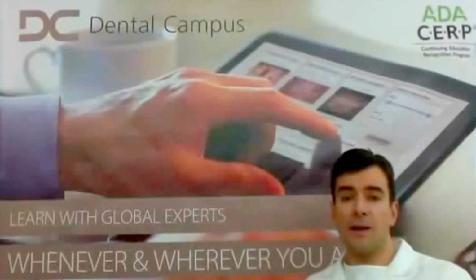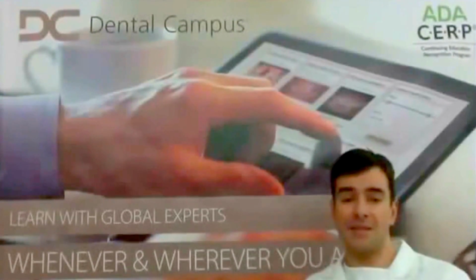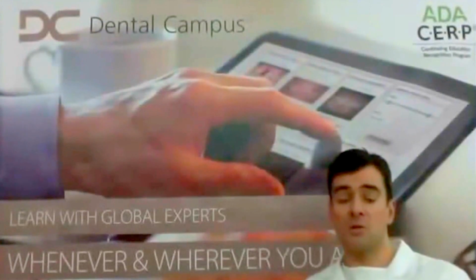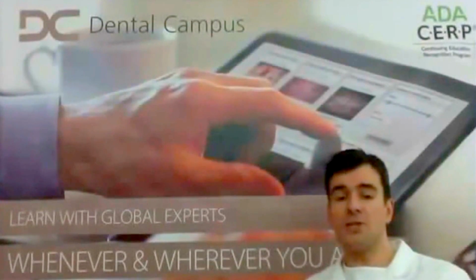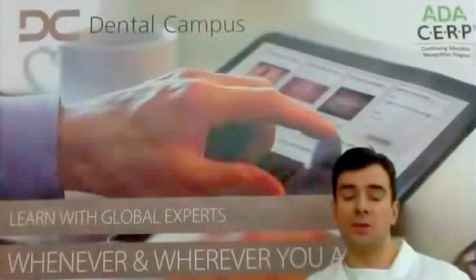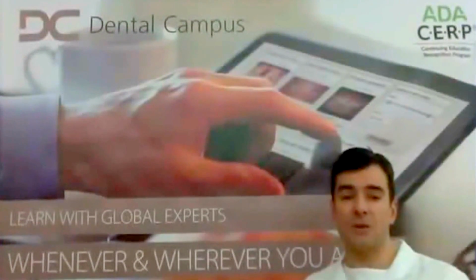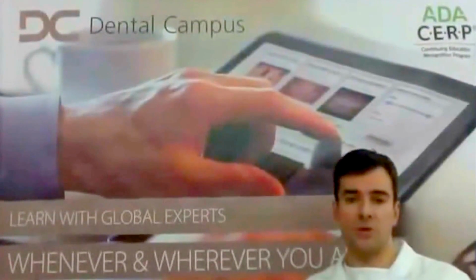If you take a look at the clinical literature, I would say 80 percent or even more of the clinical studies on immediate restoration, which by the way are showing very, very good data in terms of implant survival and bone stability, require at least 30 to 40 Newton centimeter of insertion torque, and the clinicians who are using the implant stability quotient require at least 60 to 65 ISQ in order to perform an immediate restoration.